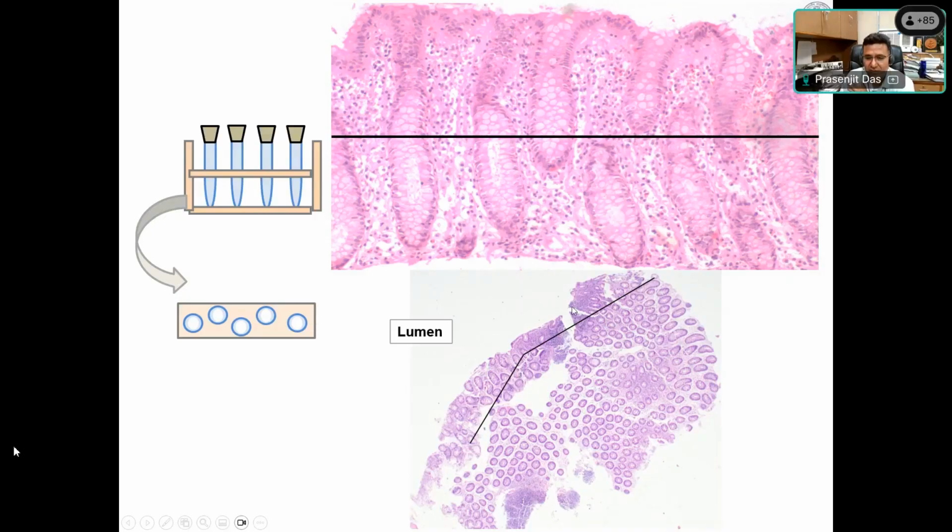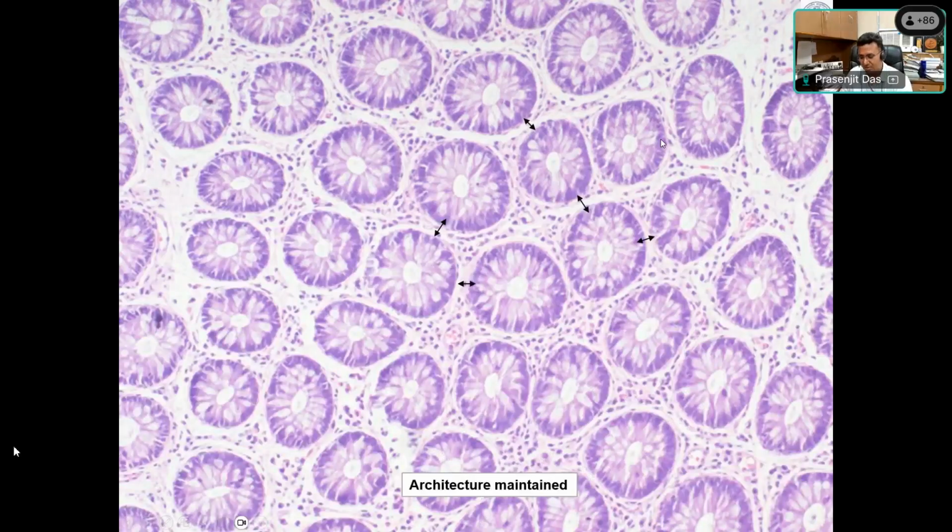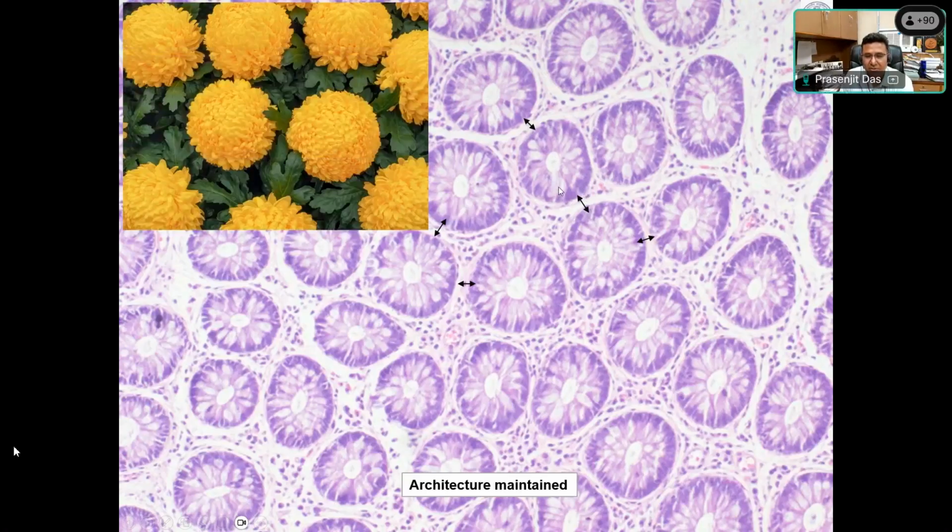Here you can also see some lymphoid aggregates, but this is more towards the luminal surface, and some inflammatory cells, but that is not present everywhere, though we cannot say which part is the deeper part because it is a transverse section. So roughly you can see it is only polarized to some part, not distributed everywhere. And as she told, the spaces in between the crypts will be increased if there are increased inflammatory cells. So this rule we have to apply, and here it has already been spoken. So that means it is an architecturally normal biopsy, and the inflammation is also not great.